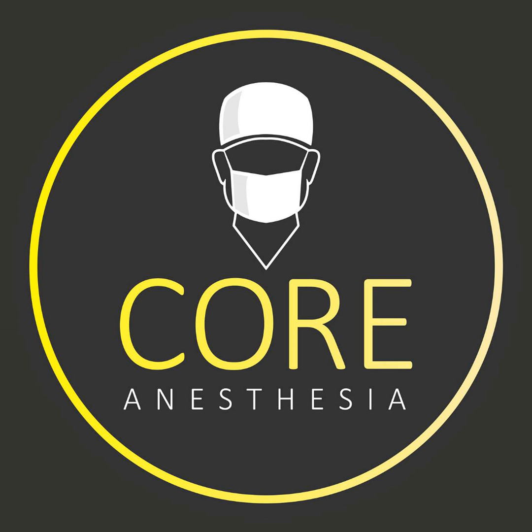Other things about the ET tube, so they all have a Murphy's eye, which is a second opening at the end of the tube. And you just got to be really careful here. You got to watch your stylet if you use a stylet, that it doesn't poke through this, and it can also damage the tissue during intubation if that's the case.